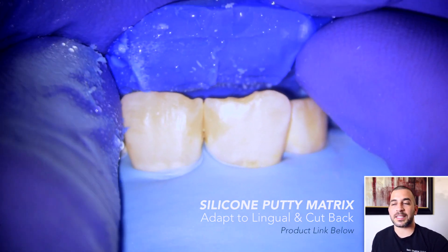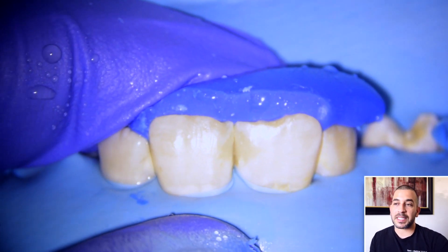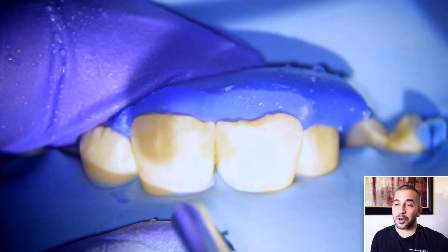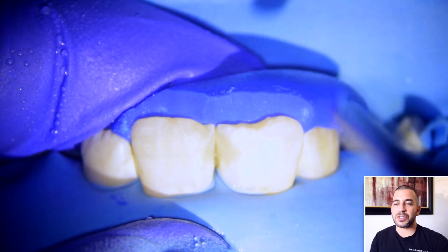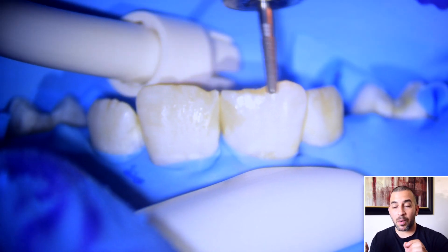These are the teeth that we're working on today and as you can see, the incisal edge or the mesial incisal edge have been broken down a bit. His teeth are a bit wide and they do have these decalcification fluorosis spots on them which make them look very white.